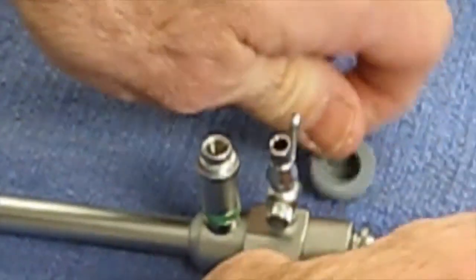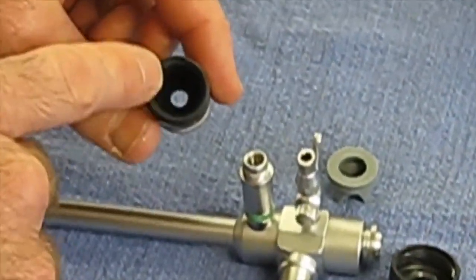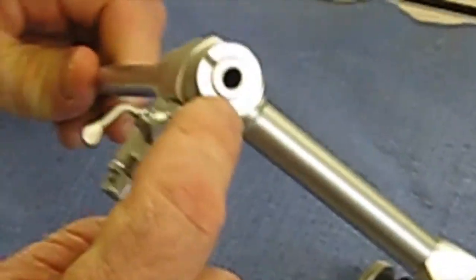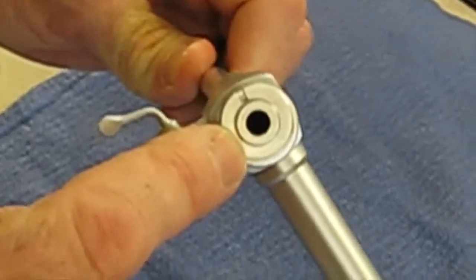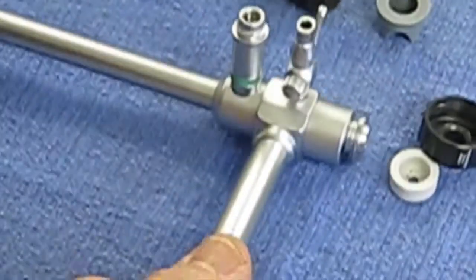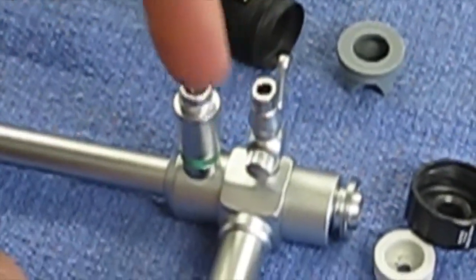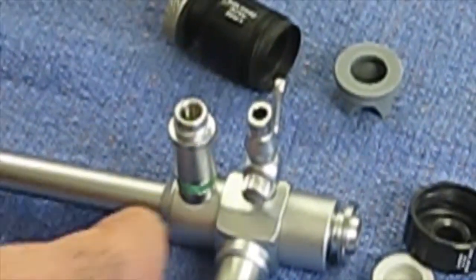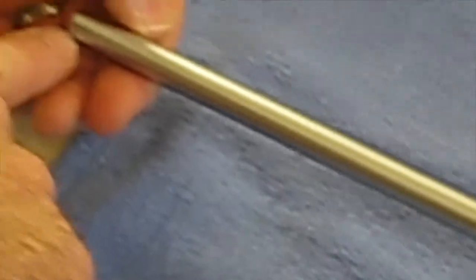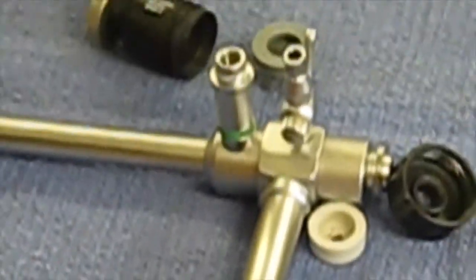All of this can be soaked in enzymatic cleaner, including the scope. And then make sure the barrel of this is clean. There is a cleaning brush that you can run down through the channel of the operating scope to drive out any organic matter. And then in the end, you also want to hook up a syringe and flush the enzymatic cleaner directly into the valve so that it can come out both this port here and that port and the tip of the scope, in order to make sure it's completely flushed out.